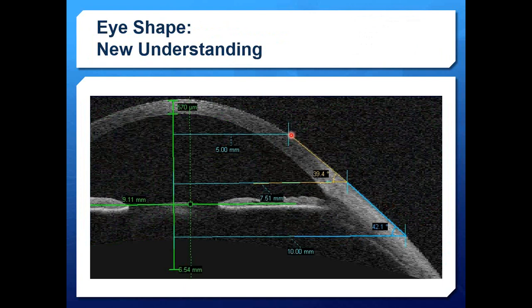And one of the first studies that we did was to look at the angles that form through 10 millimeters across the corneal surface to 15 millimeters across the sclera. And what is the angle that begins to form? Notice how the eye surface is very straight line or tangent in shape. It doesn't have curve. The cornea more curved, but the peripheral cornea, limbus, and sclera become a little more straight lined or tangent in shape.